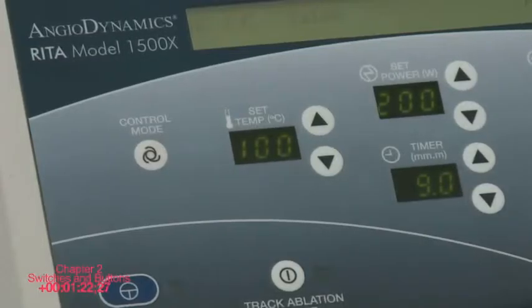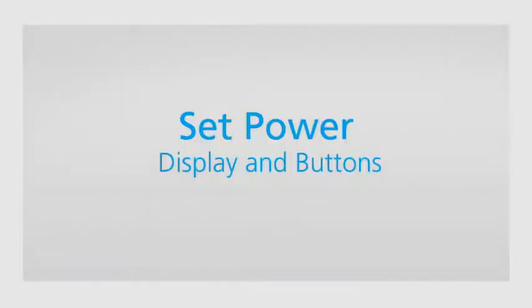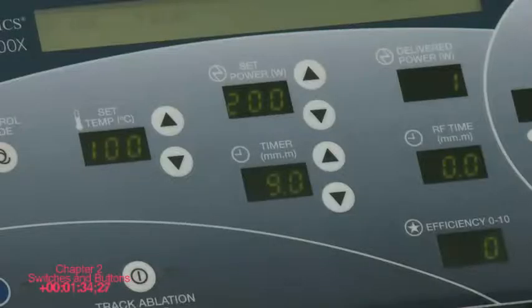Note, if the target temperature is not reached within 30 minutes from the start of RF energy delivery, the RF power automatically turns off. Set power watts display. Displays the maximum power setting in whole units of watts.